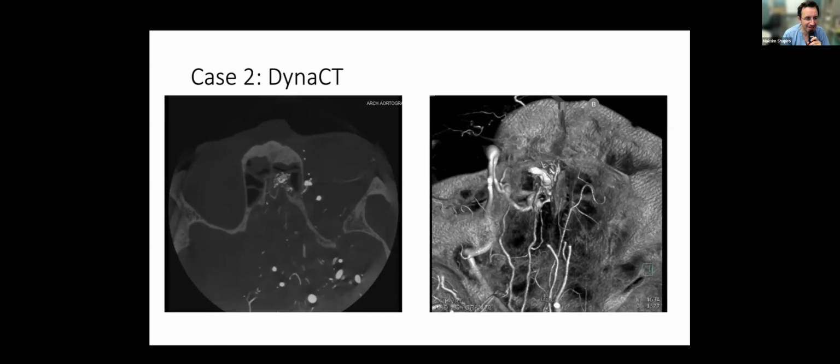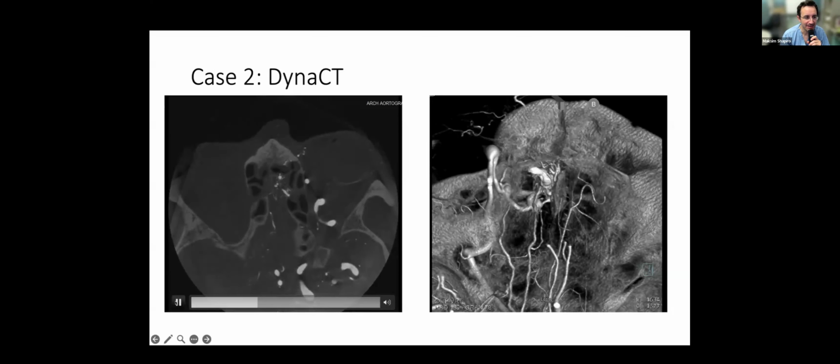No, it's a great question. As far as I'm interpreting this angiography, especially this one image right here, the level of the fistula, the level of the hole, which as we know these fistulas usually are, it's one hole. The hole itself is in the ethmoidal air cells, from what I can see here. In the interest of time, we could probably discuss later, but it's a great question.